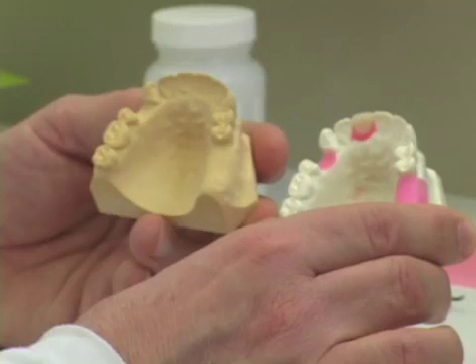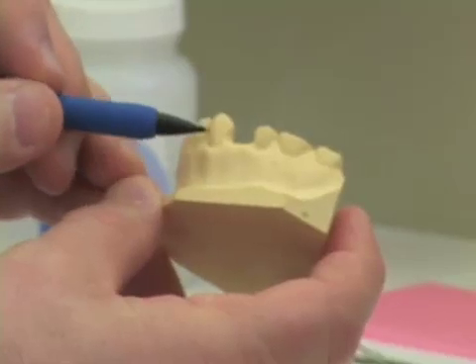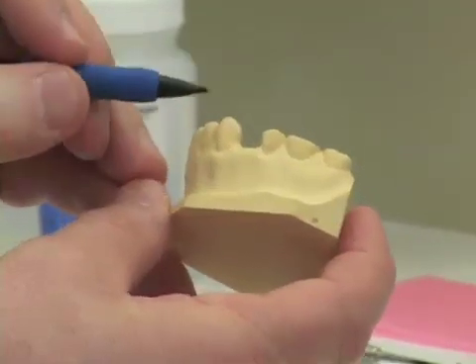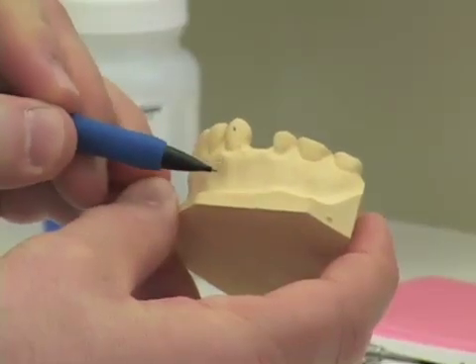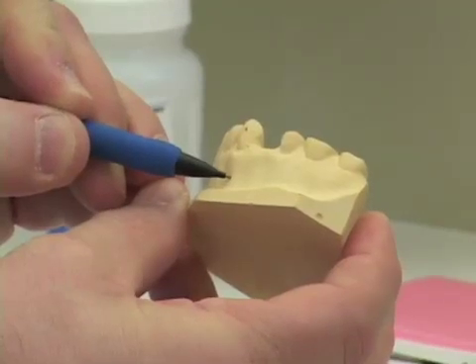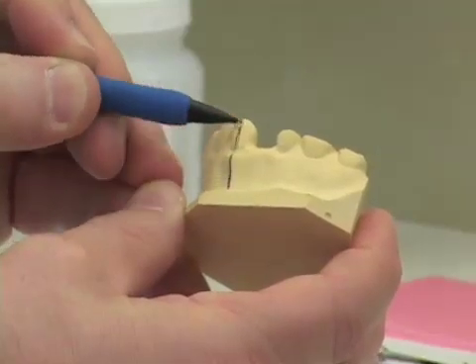What I want to do first is mark the proposed location for our implants. I always view the cast from the buccal or labial and estimate the direction and location of the roots of the teeth adjacent to our edentulous area. I typically make a mark in the center of the clinical crown and then mark what I estimate will be the center of the root, connecting those two marks with a line representing the long axis of the tooth anterior to the edentulous space.